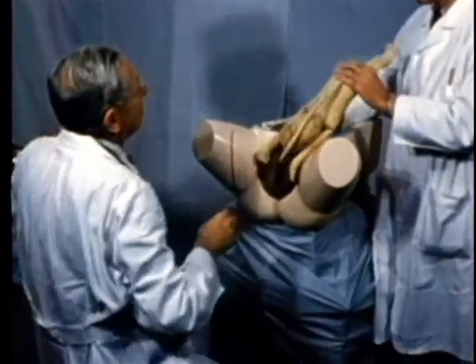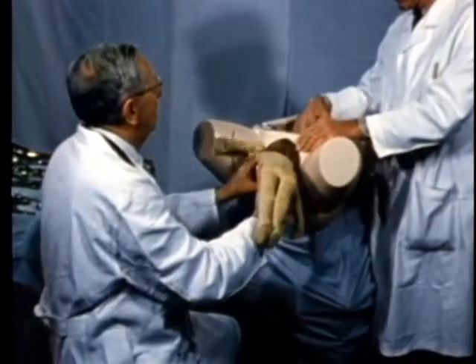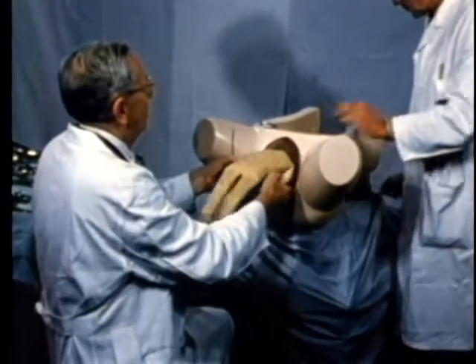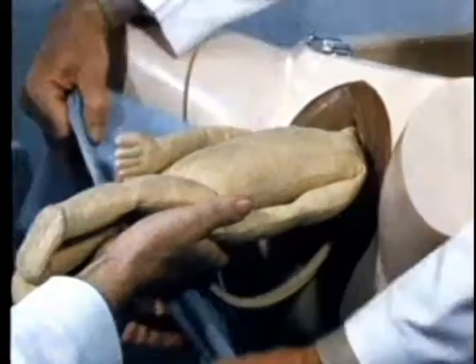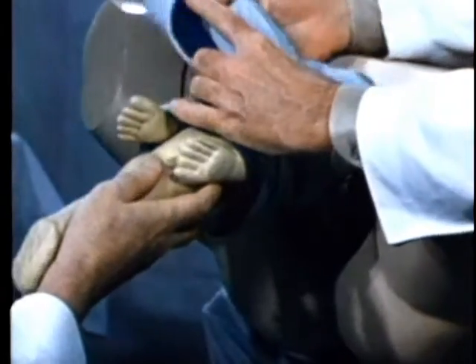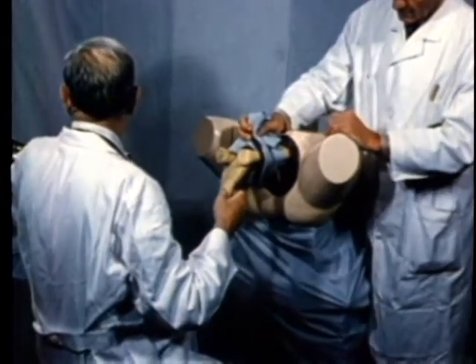There is another maneuver advocated by Savage, which may simplify the handling of the arms: a towel is placed around the body, enclosing the arms and keeping them out of the field of operation.